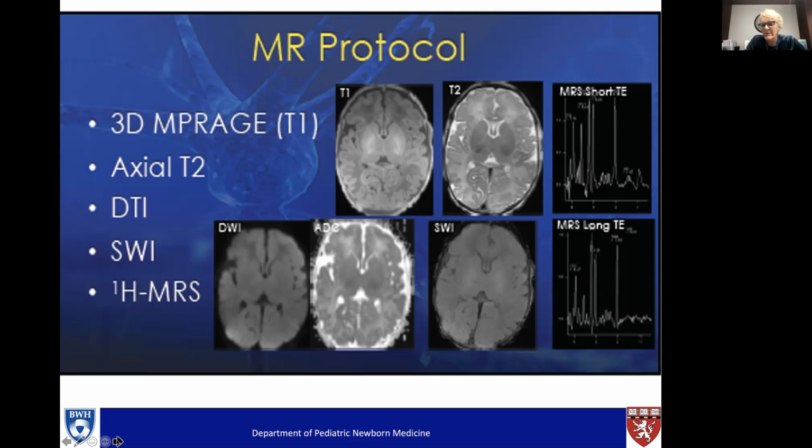In diffusion imaging, we're resonating a whole water molecule. So the whole water molecule has to move and move back, and then we try to track it, which is actually really mind-blowing to think we can even do that, but it's why the resolution is not as fine.